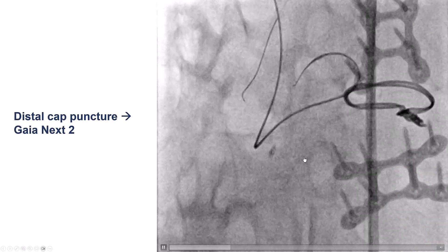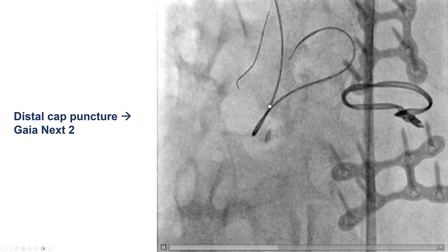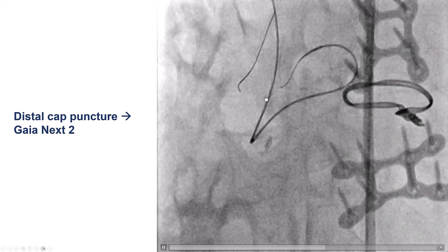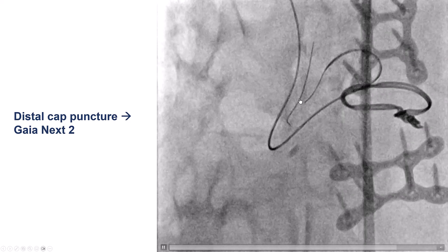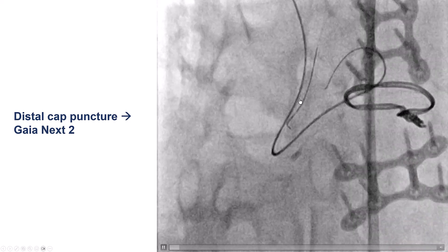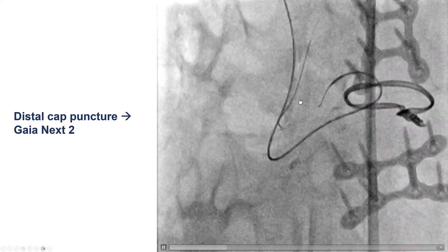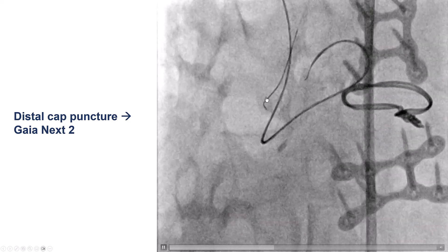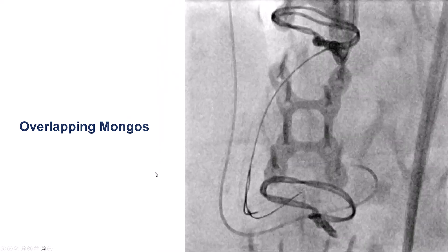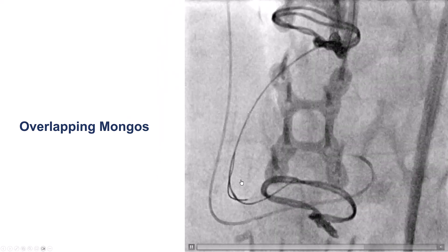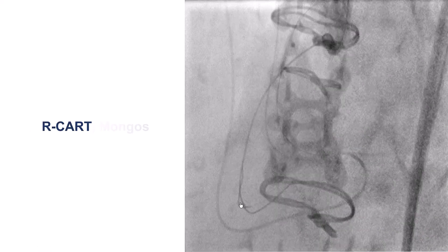We then tried to puncture the distal cap using the Gaia NX2 guide wire. The distal caps can be resistant, but typically they are less so than the proximal cap, because often they are not exposed to fully systemic pressure after the vein graft is occluded. We were then able to advance a polymer-jacketed Gladius Mongo wire antegrade, now having overlap of the wires in the distal RCA.